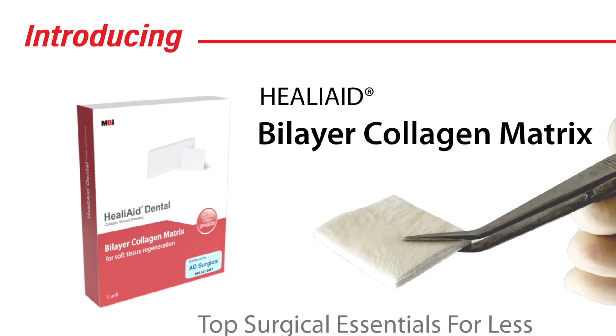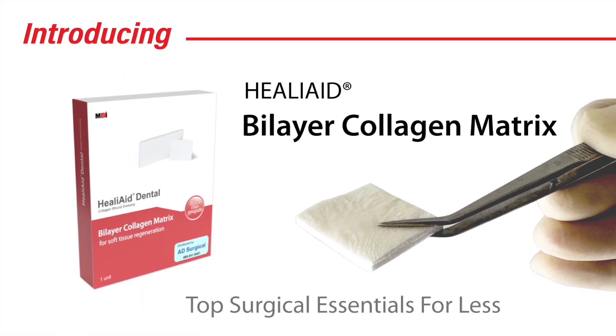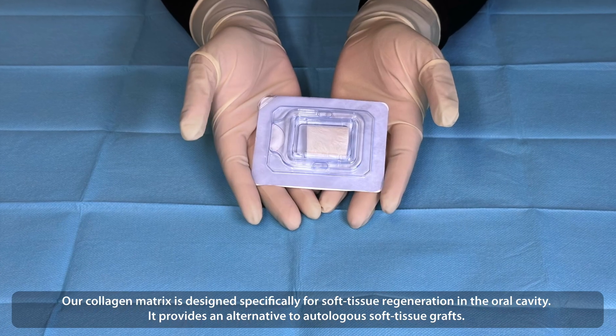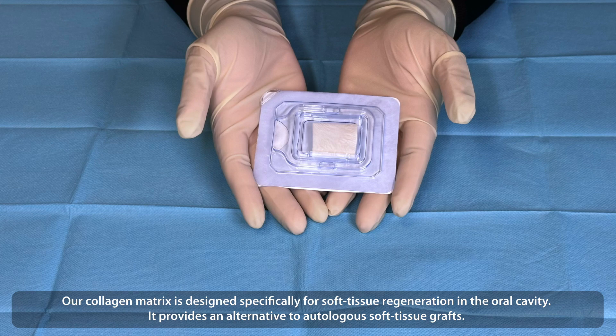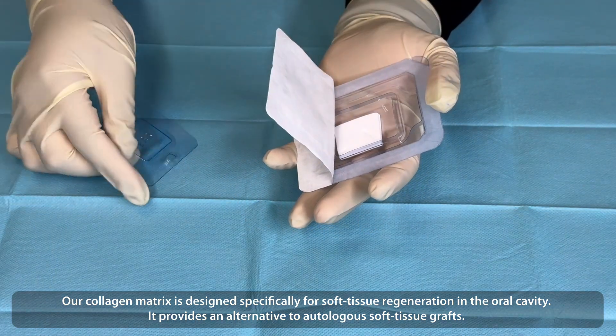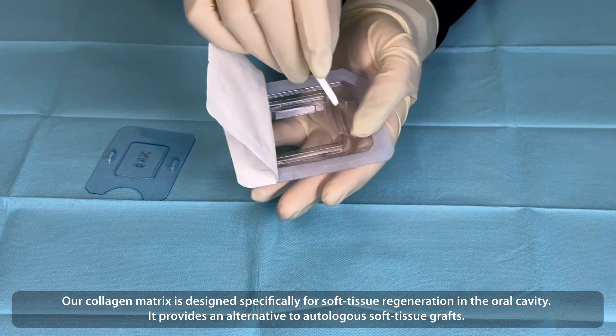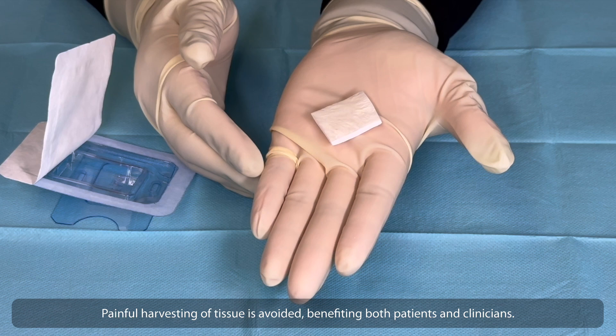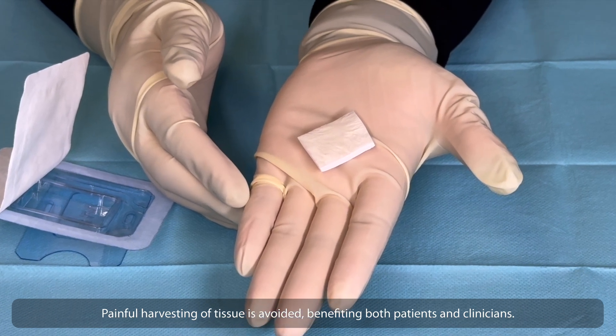Introducing HealiAid Bilayer Collagen Matrix — Top Surgical Essentials for Less. Our collagen matrix is designed specifically for soft tissue regeneration in the oral cavity. It provides an alternative to autologous soft tissue grafts, so painful harvesting of tissue is avoided, benefiting both patients and clinicians.